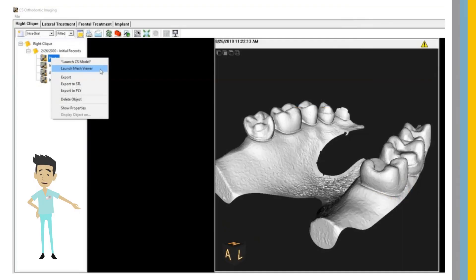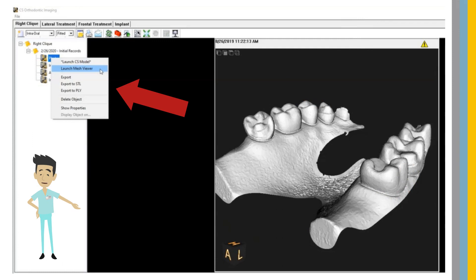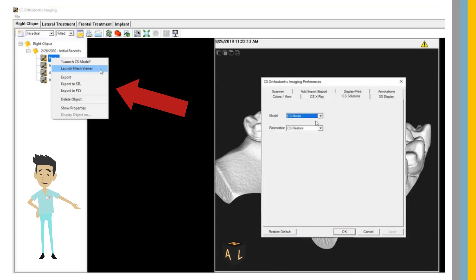Now, using new right-click menu options, you can launch alternative CS Solutions tools. If CS Model is set as the default viewer, you can launch CS Mesh Viewer instead by right-clicking on the CS Solutions object and selecting Mesh Viewer.